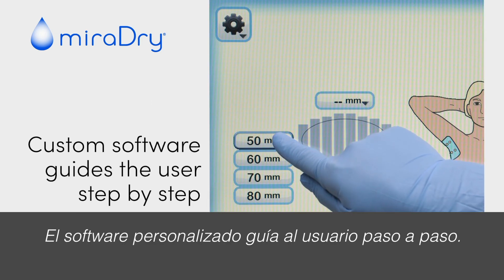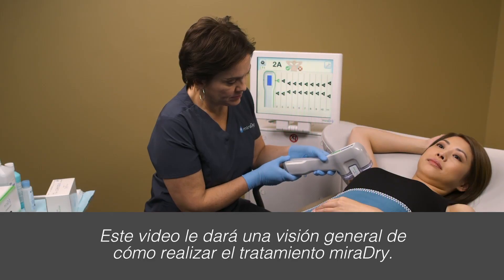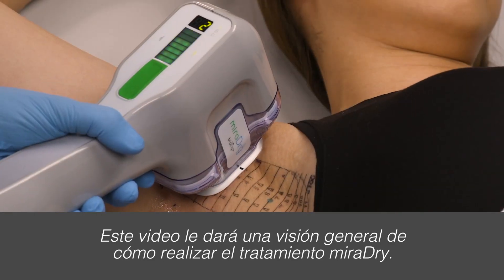Custom software guides the user step by step. This video will give an overview of how to perform the Miradry treatment.